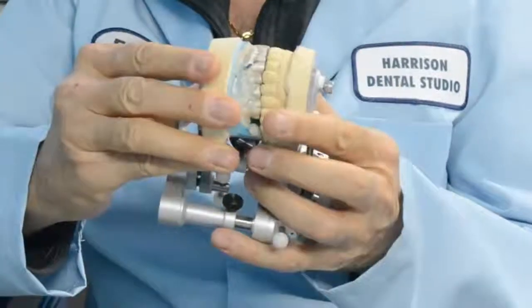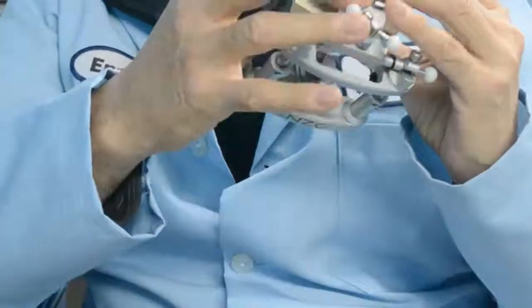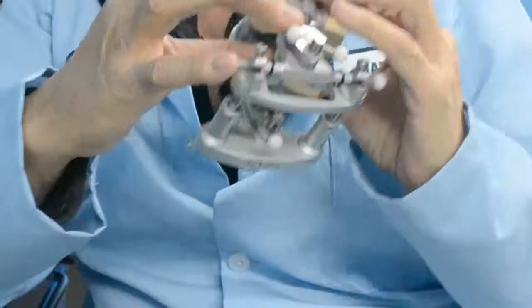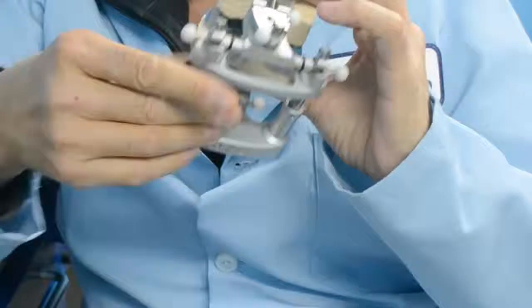To articulate, loosen up all the screws. Once you loosen the screws, you have complete mobility. You set the bite, then hold the articulator firmly together. You adjust your vertical stop, and lock everything in place by tightening the screws, in the same way you loosen the articulator.